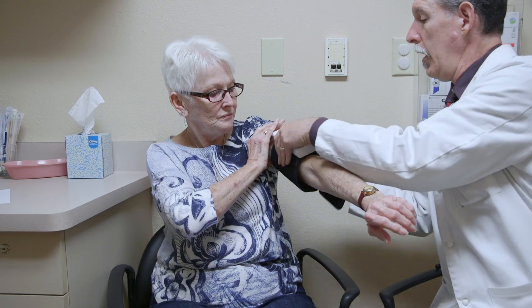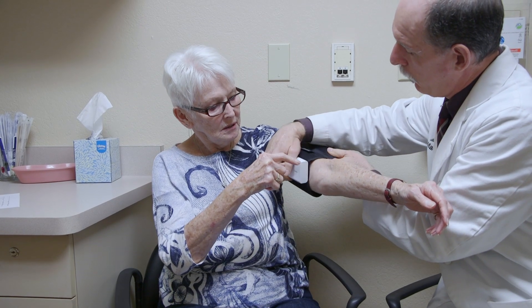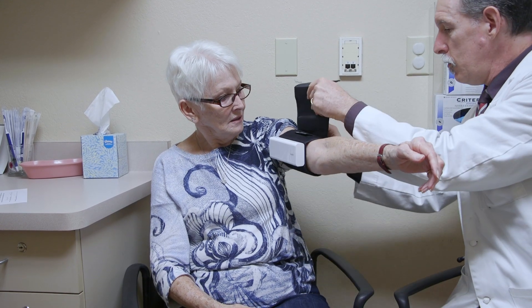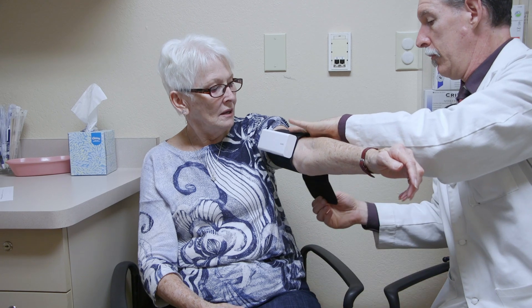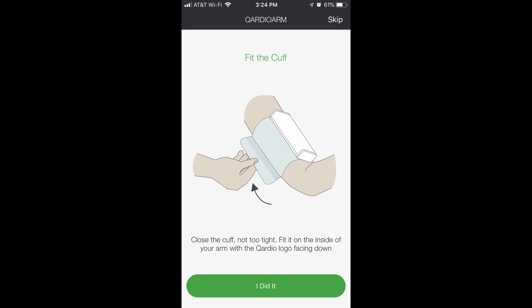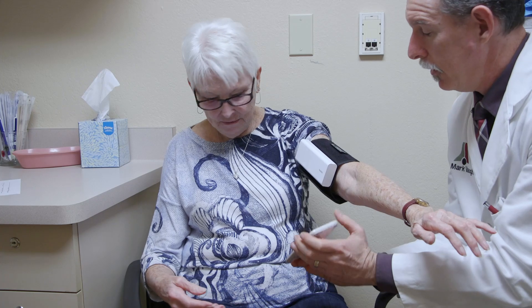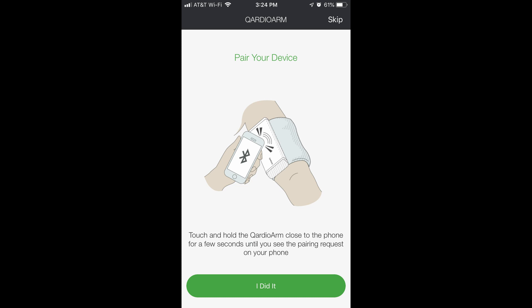We want to have it right there — it may work a little bit over that way too, but for now right there. It's important not to do it too tight. The temptation is to get it really tight, but you want to be able to get a couple of fingers in. It can move a little — that's okay. Preferably you'd rest this arm on a counter. To pair the device, you're supposed to touch the phone to it and then hit 'I did it.'